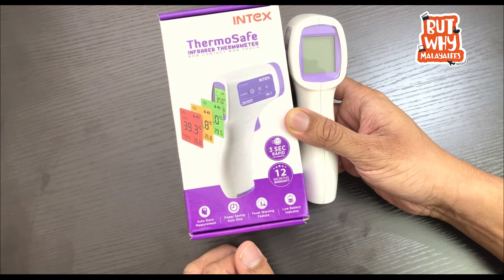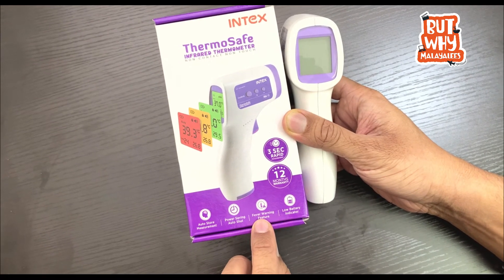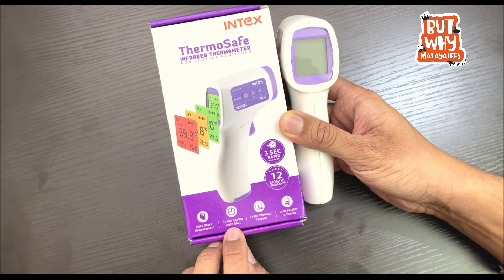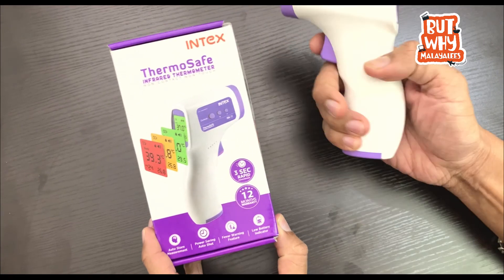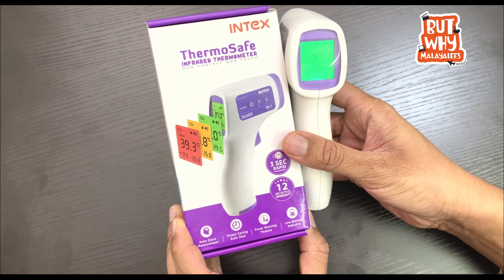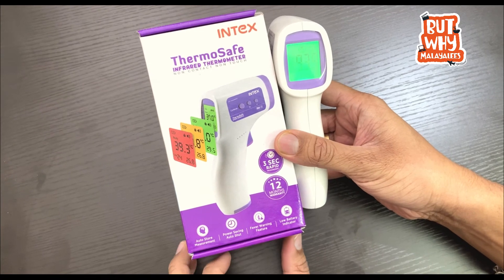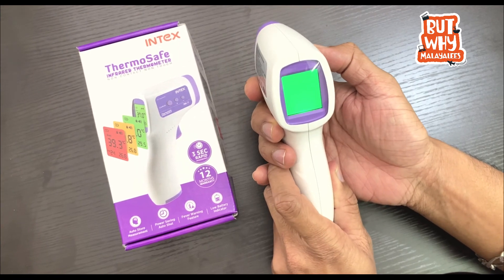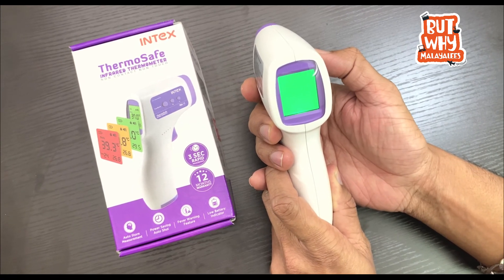This product comes with a 12-month warranty. It has a low battery indicator and a fever warning feature, with a high temperature display. There is a power-saving auto-shut feature — it shuts down after 30 seconds. It also has an auto-store measurement feature with memory 1 and memory 2, so you can save temperature measurements.